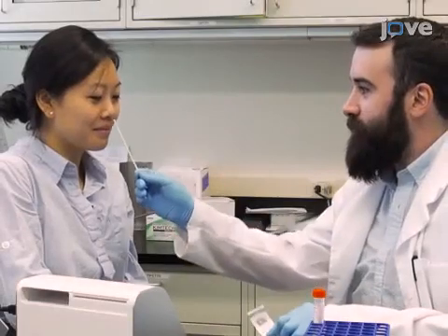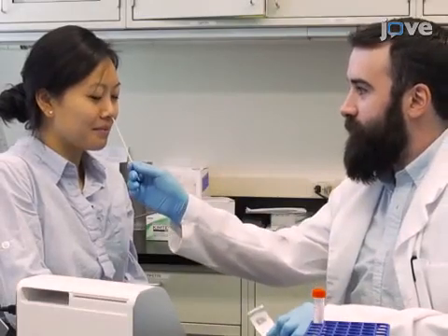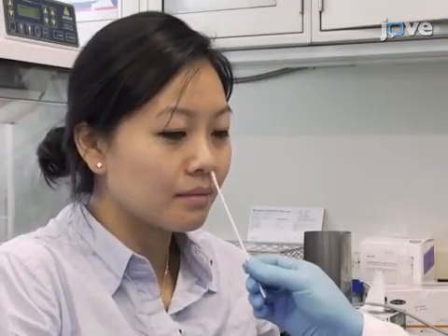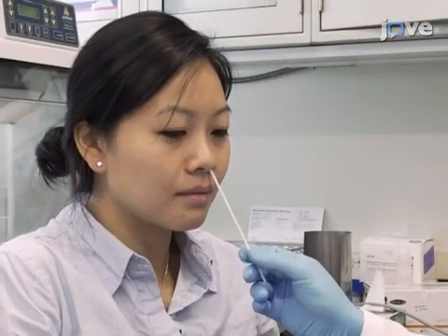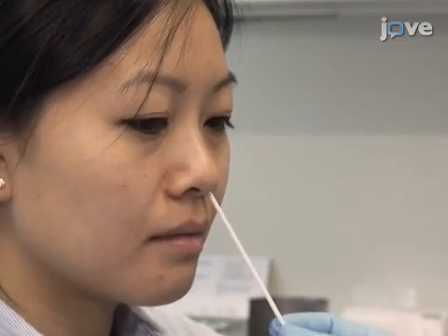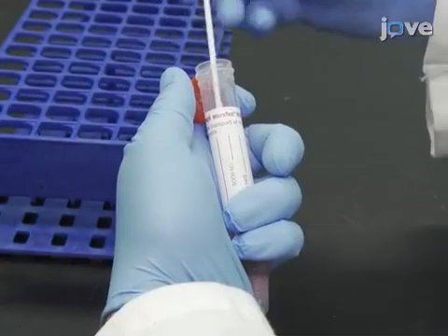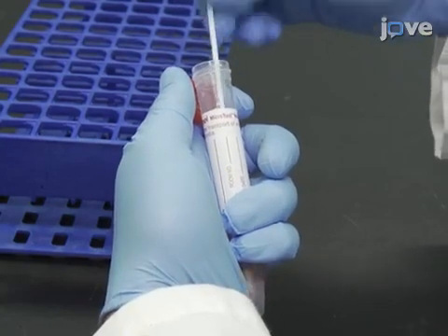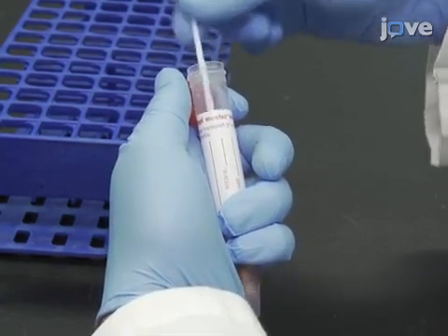To collect a nasal swab sample, insert the swab into the nostril that has the most visible drainage or that is most congested. With gentle rotation, push the swab into the nostril until resistance is met and rotate several times against the nasal wall before slowly removing from the nostril. Subsequently, store the swab and transport it in a vial containing three milliliters of viral transport media.